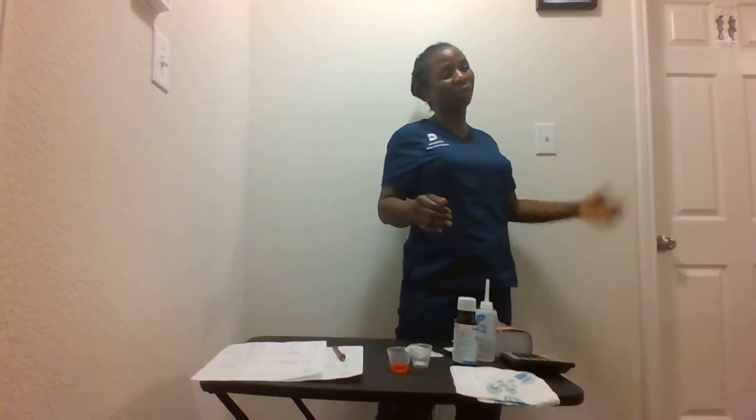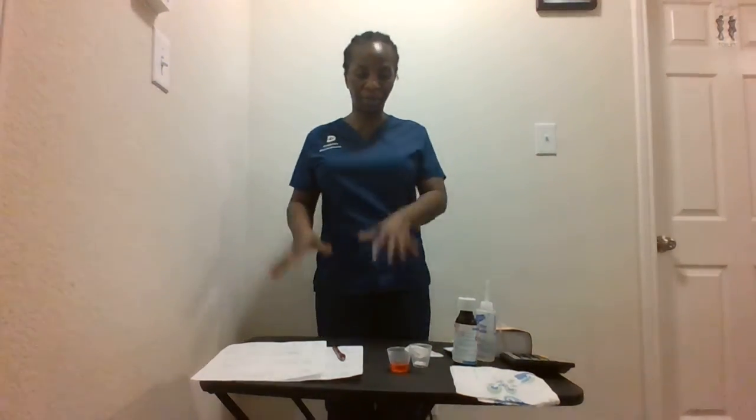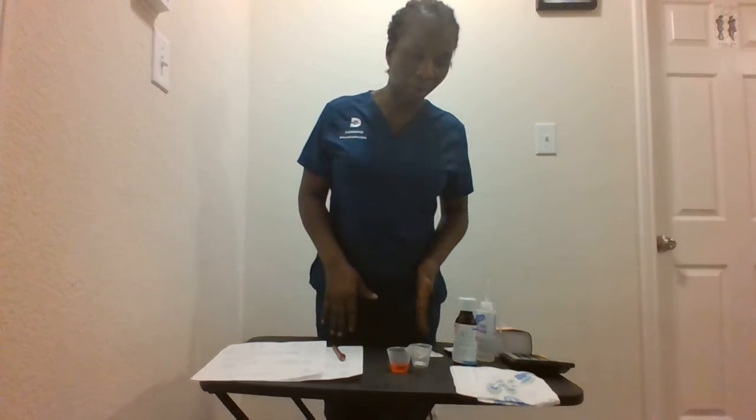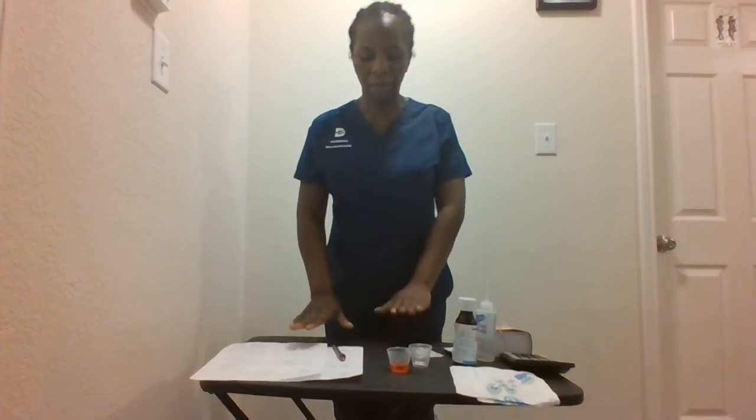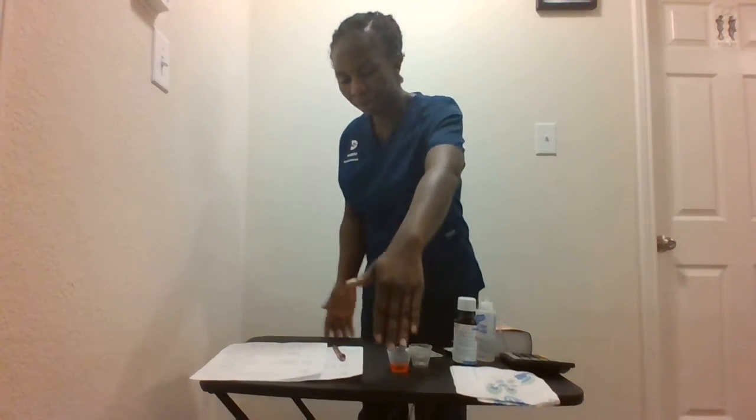I'll perform hand hygiene again and move to the enema. How do I do the enema? In case I want to do it in the patient's room and on the bed, first thing I'm going to do is make provision for the bedpan or commode, and access to the toilet. I'll make sure I have a waterproof pad on the bed, and I'll make sure the 2 rails of the bed are up.